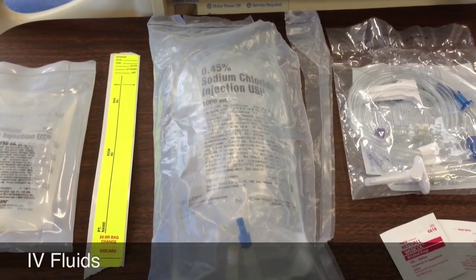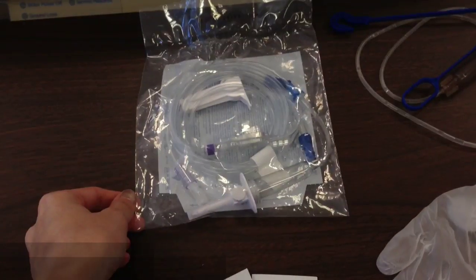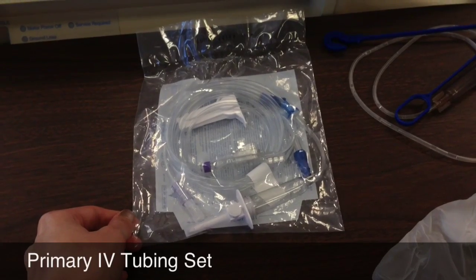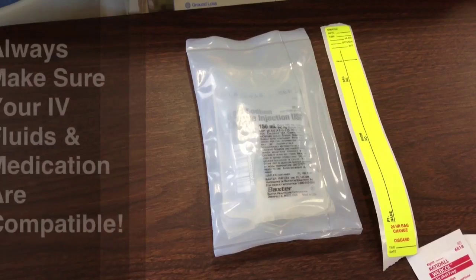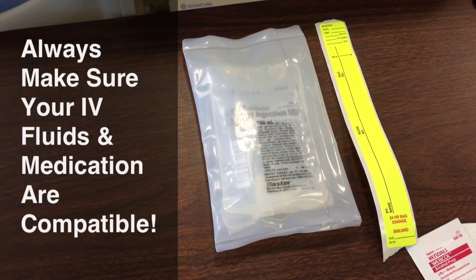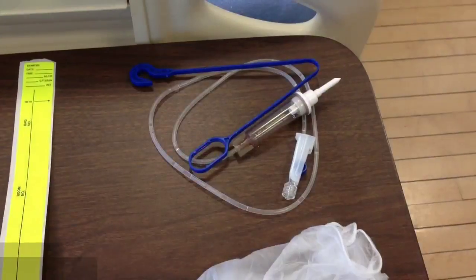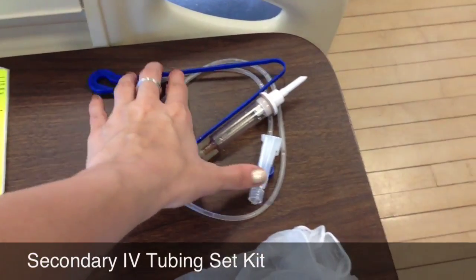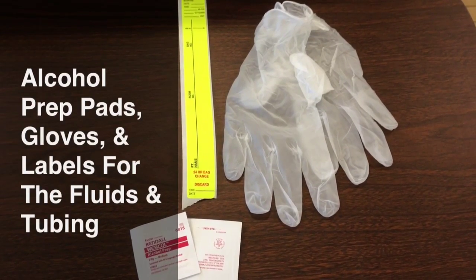The next thing you're going to want to do is gather your supplies. You're going to need IV fluids and IV tubing — though if your patient already has a primary line running in their room, you wouldn't need to gather these. Next you're going to need your medication bag. It's important to make sure that your IV fluids and your medications are compatible. You'll also need a secondary IV tubing set kit to hang your medication bag.